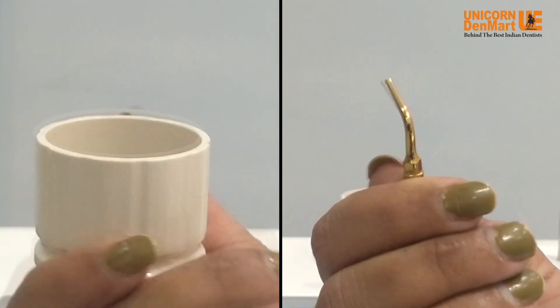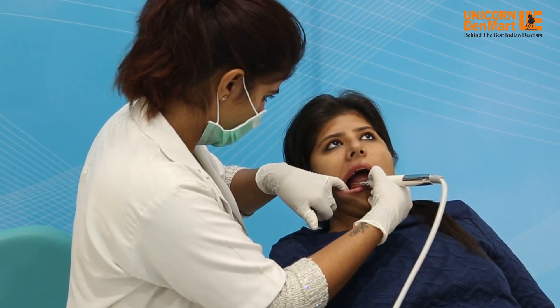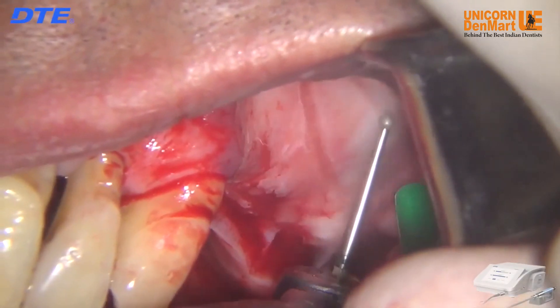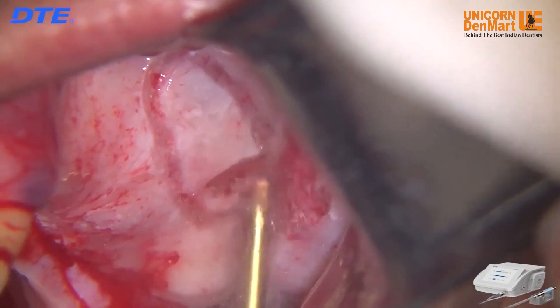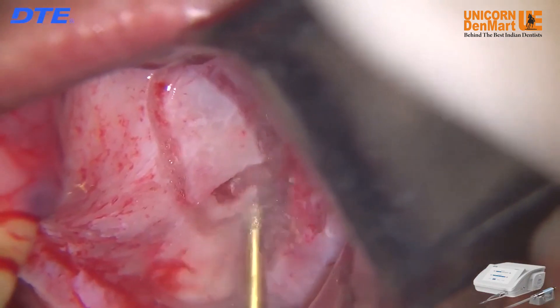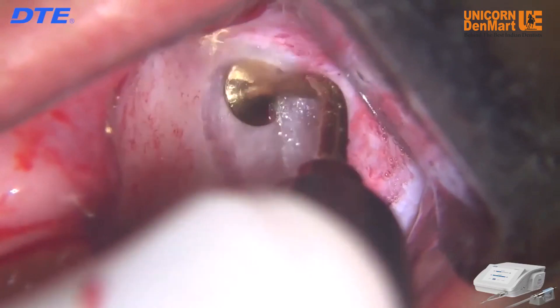The unit comes equipped with a chuck for tip attachment to the handpiece. This advanced technology is a definite advantage over conventional rotary technique, cutting bone without damage to delicate anatomical structures, making it highly effective in sinus lifting and nerve relocation. Surgery X from DTE offers better post-operative healing, minimally invasive bone cutting, and a clear operation site due to minimum bleeding owing to the cavitation effect.